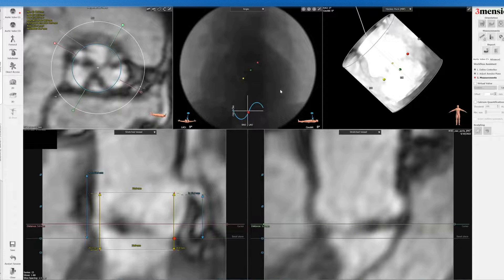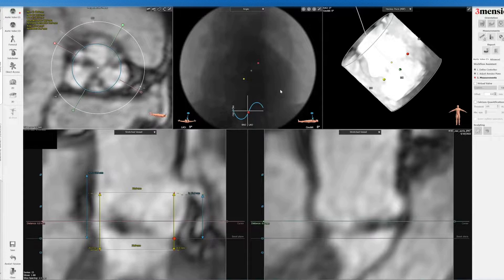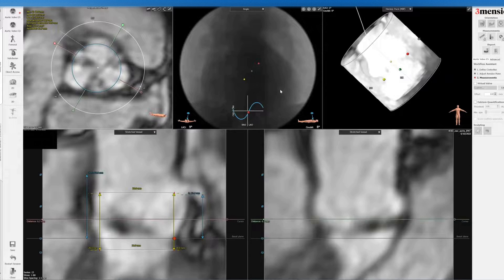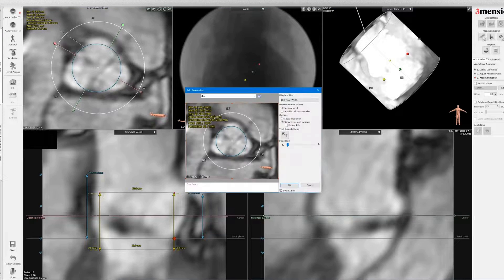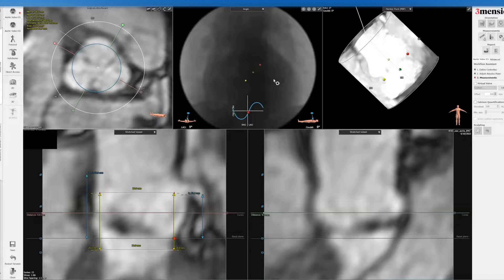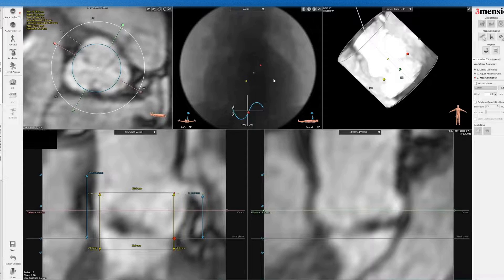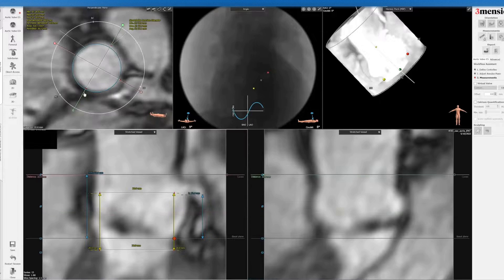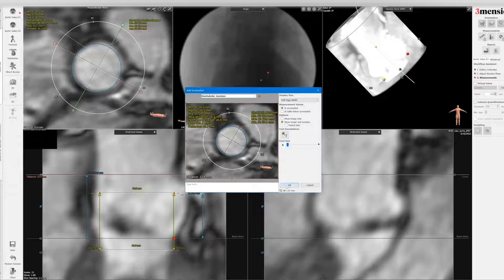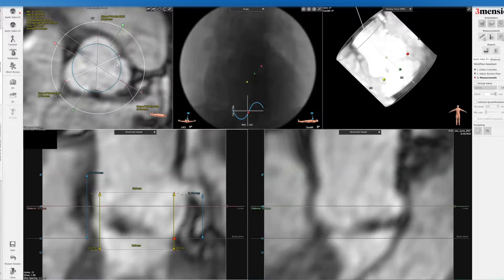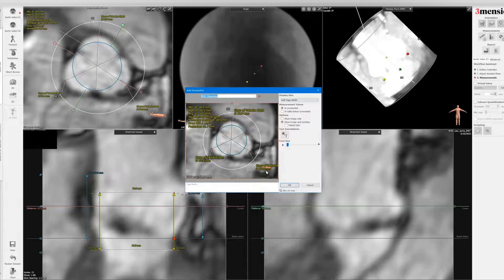You can actually see the leaflets here are dark, not bright — it's opposite of CT. Then you go to the STJ and do the same kind of workup as for all TAVR cases. You can see how the 26 millimeter circle fits with the aortic root.